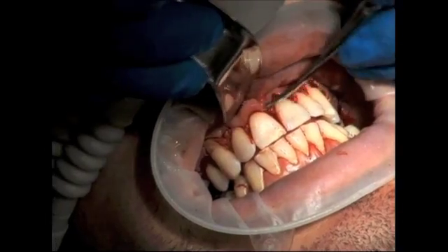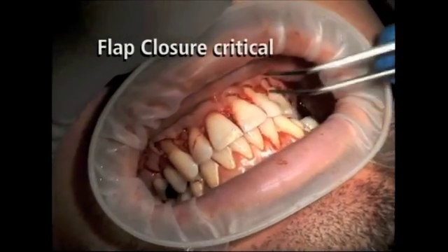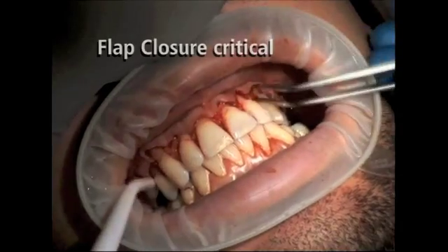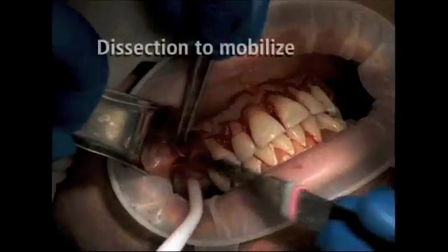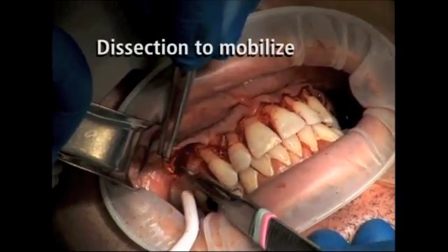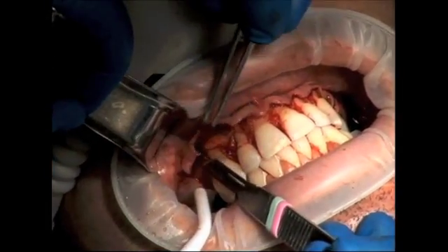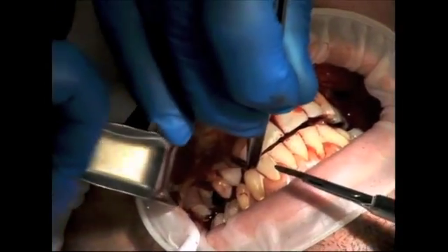The root should also be scaled at this time. Despite the fact that the flap has been reflected well past the mucogingival junction, the flap is hardly mobile — this can be easily tested with a simple cotton plier. In order to properly mobilize the flap, sharp dissection is a must. Utilizing a sharp number 15 blade, the sharp dissection is initiated at the distal vertical incision and carried towards the midline towards the other distal vertical incision.